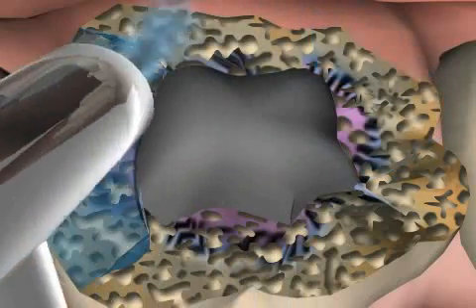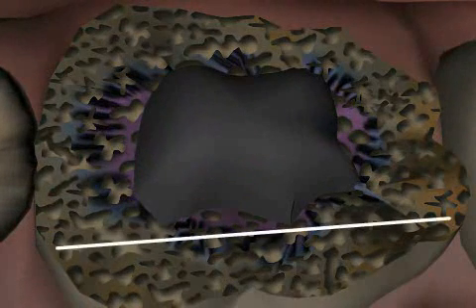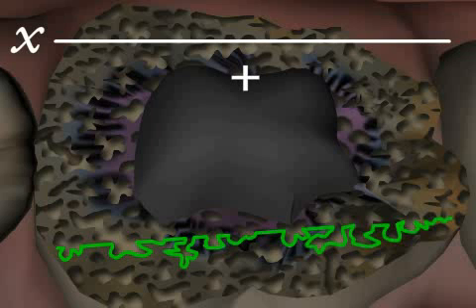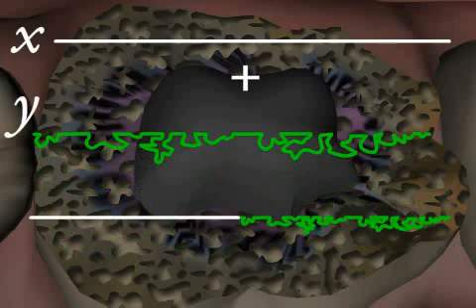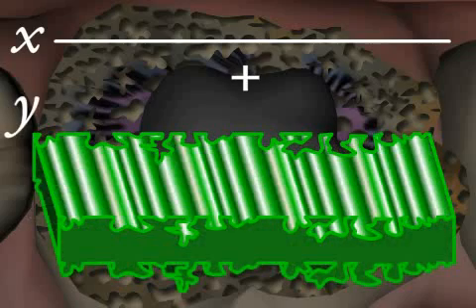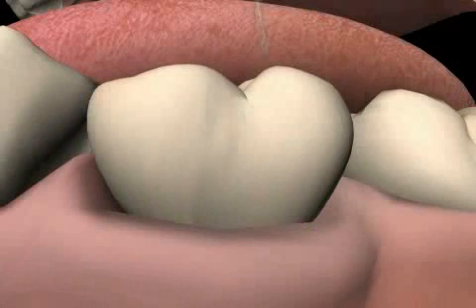Let's assume that the initial surface of the tooth, including the inlay, amounts to a length of X. Examining the gluing surface closely after the etching procedure, we can see that this surface has been expanded by a factor of Y. However, since the etching pattern is not two-dimensional but three-dimensional, the gluing surface is actually enlarged even further.